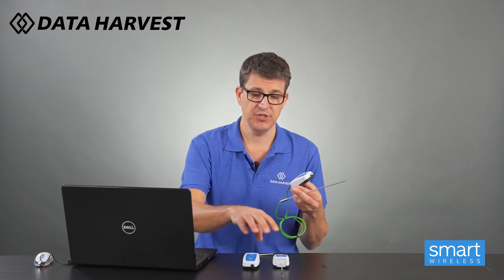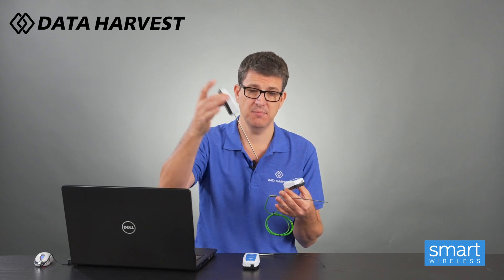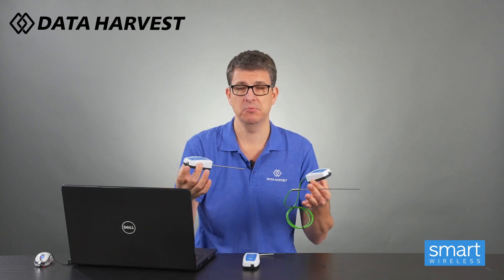Now one of the most common things people want to do is the Bunsen burner experiment to prove whether the yellow flame or the blue flame is the hottest. Do not use these two sensors for that. Both of these have a range of minus 40 to 125 degrees - great for everyday experiments. This can go in boiling water, so if you want to heat it up with a Bunsen burner or put it in a kettle, that works fine - the experiment from 20 degrees up to 100 works perfectly.